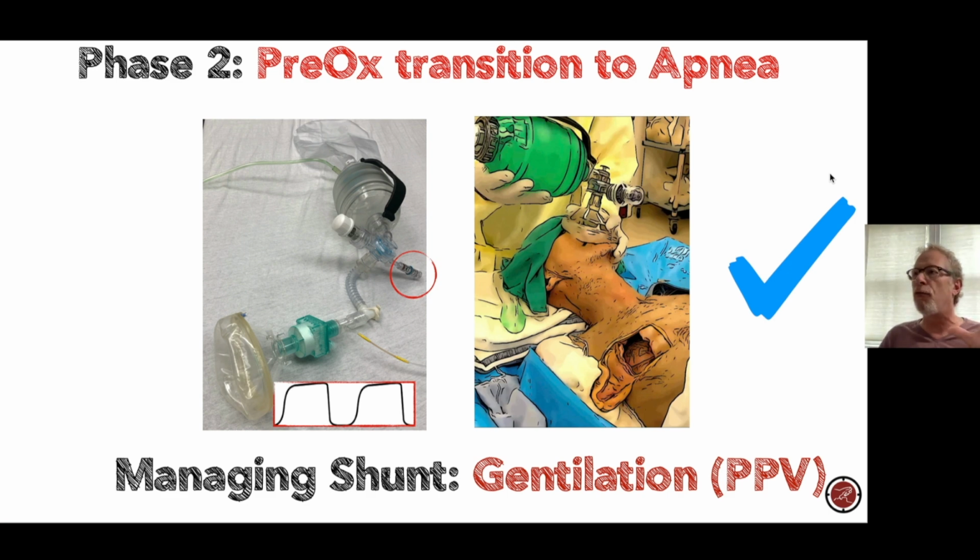They're looking at waveform, right? And what you see in that picture to the left at the bottom is what a normal waveform would look like. The advantage of doing this technique as opposed to the apneic technique is that I can check my mask seal. I can look there and see my breath-to-breath information with waveform and say, I don't have a leak, right? I don't have this variable amplitude, almost sinusoid type of variable amplitude, which tells you I've got a leak. If you see that, it tells you I've got to adjust. I might switch from a one-person technique to what you should do always, a two-person technique, right?